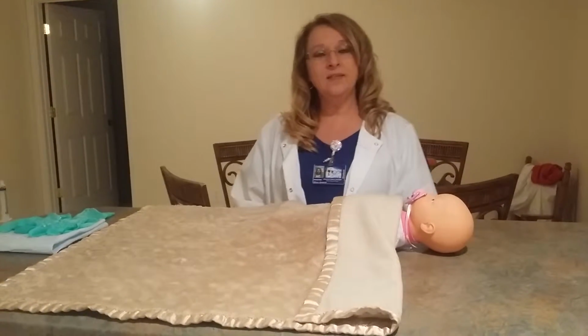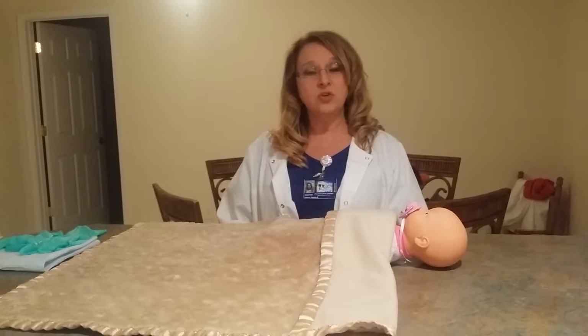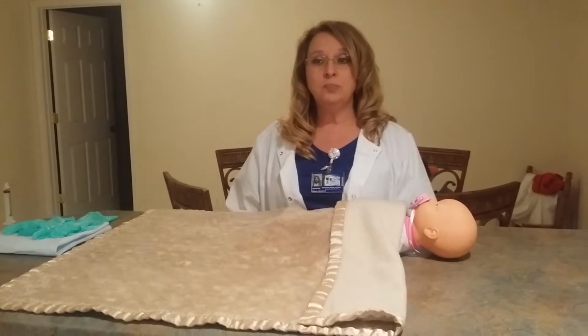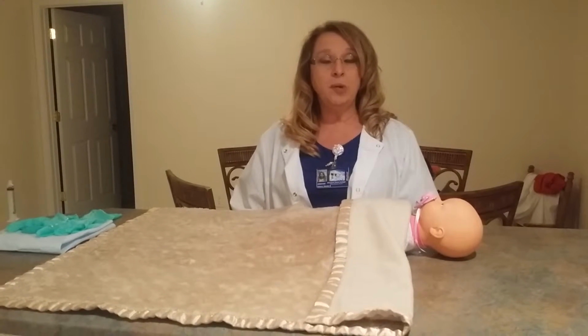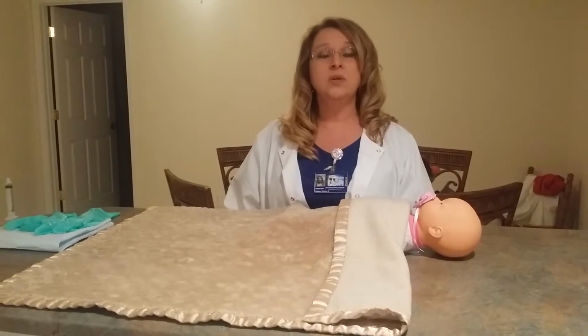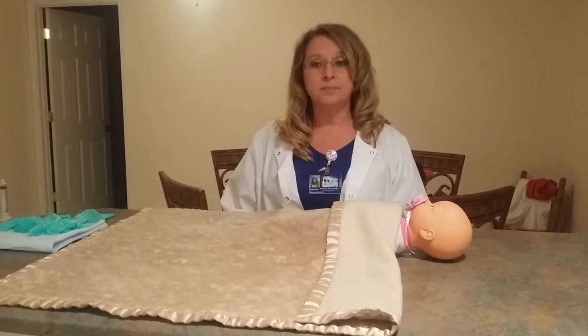My name is Deirdre, and the topic of my teaching presentation today will be removal of the indwelling Foley catheter. An indwelling urinary, also known as Foley catheter, should be removed when bladder decompression is no longer necessary, when the patient can resume voiding on their own, such as 48 hours post-surgical, or when the catheter is obstructed.